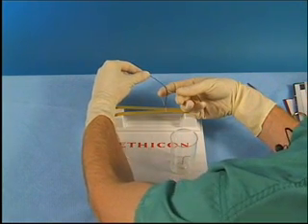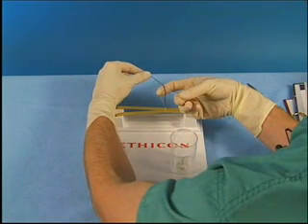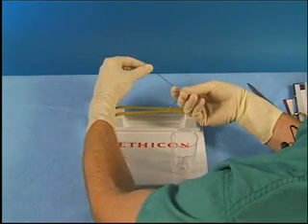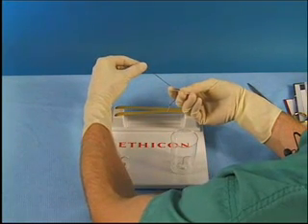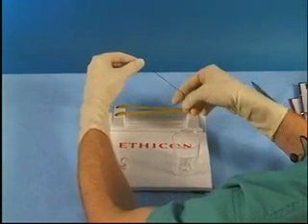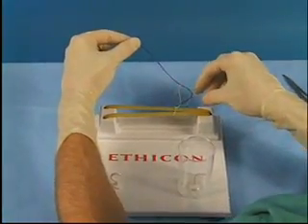It's important to hold the strands of the suture material near the tips of the second finger and thumb in the right hand. The next step is to flex the index finger and to hook the finger behind the strand of suture material that's being held in the right hand. This finger is then extended and the hand is rotated, pulling the strand through the loop.